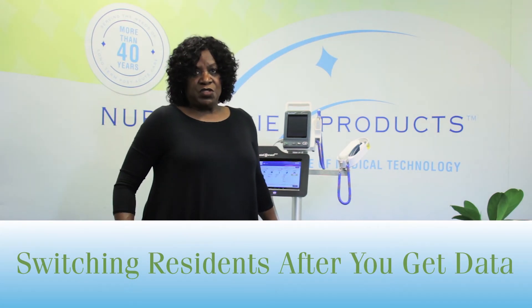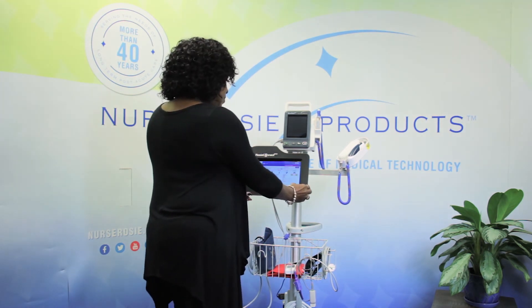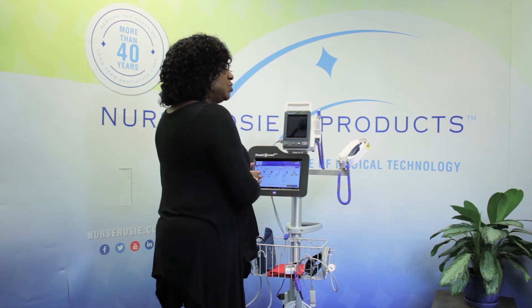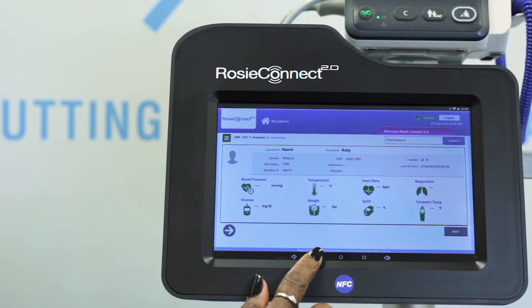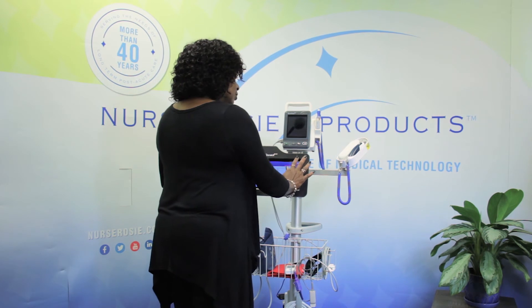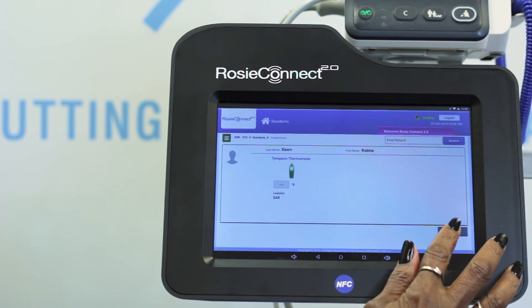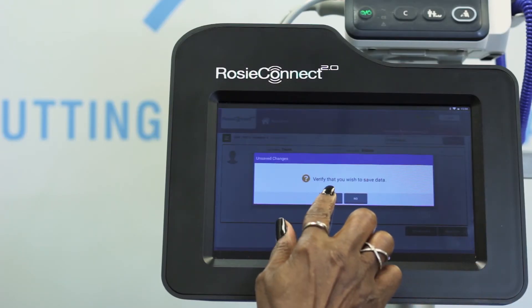Now let's talk about getting yourself out of a jam. Let's say you're in Ms. Robin's room taking her temperature, you select Get Data, then you realize you're on the Take Vitals page of the wrong resident. Don't panic — as long as you have not verified and saved the data, it's not too late to get the vitals data to the correct resident's EHR. To fix this, select the arrow on the bottom of the screen, find the resident you need, select the temp icon, select Get Data, and it will bring it into the correct patient. Then save data and say yes to save.